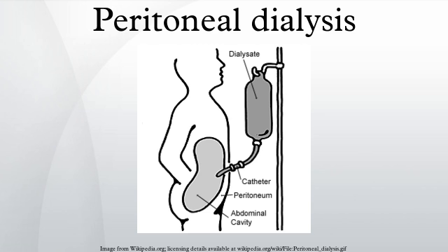Improvised dialysis. Peritoneal dialysis can be improvised in conditions such as combat surgery or disaster relief using surgical catheters and dialysate made from routinely available medical solutions to provide temporary renal replacement for patients with no other options.